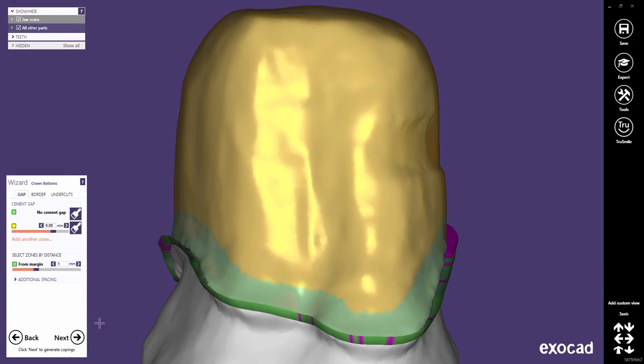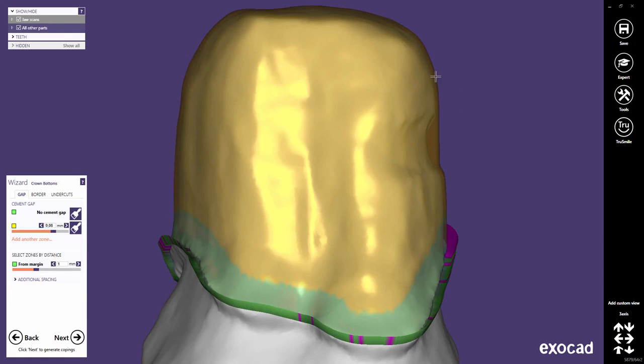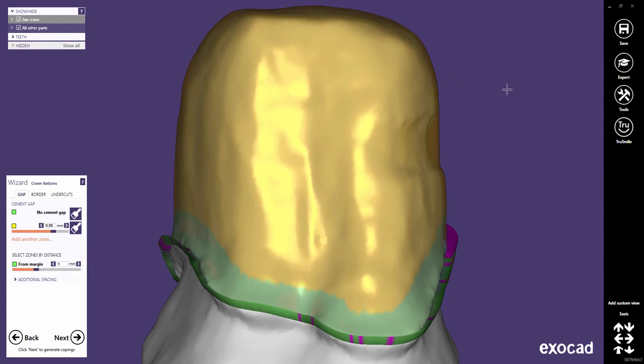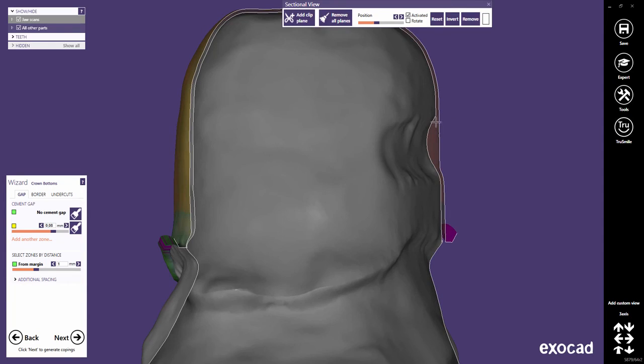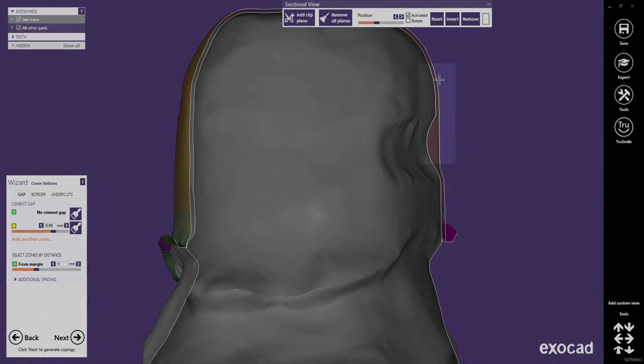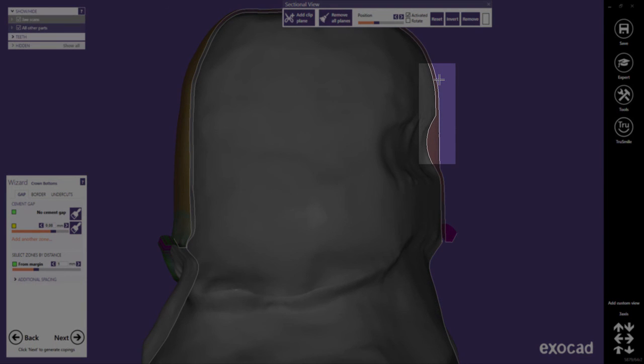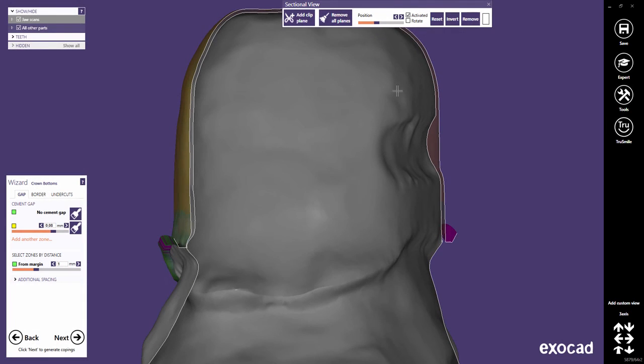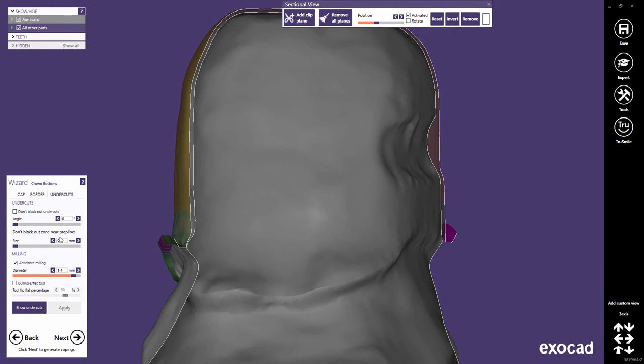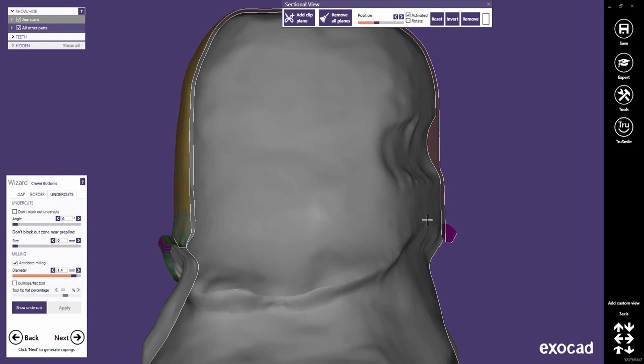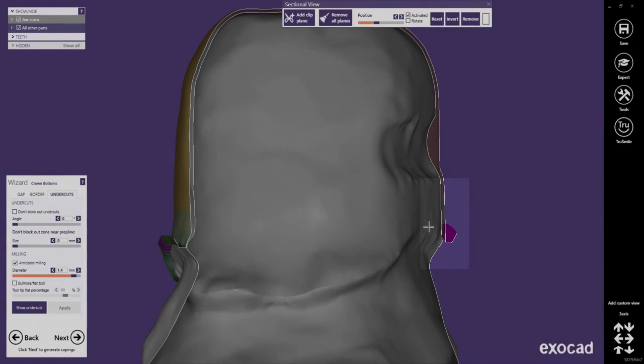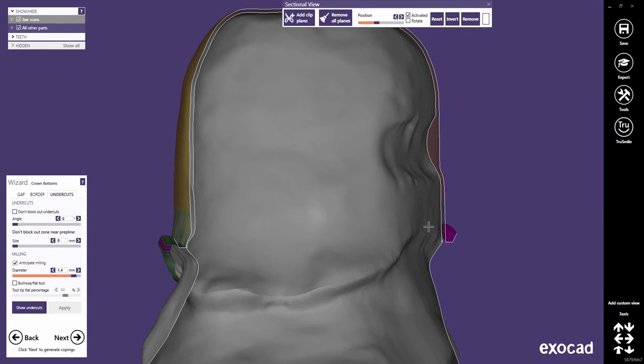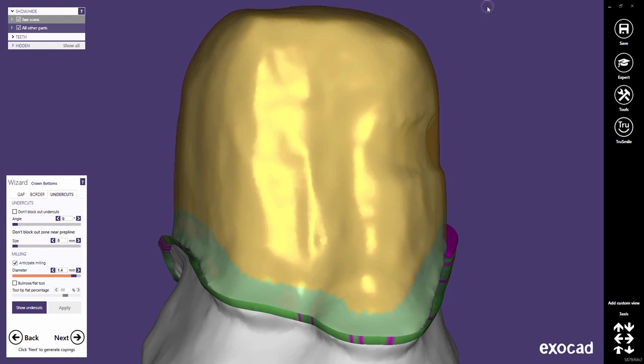For 3-axis production, material configurations typically define an additional blockout being applied after generating the cement gap to avoid any undercuts that 3-axis machines cannot mill. For the same reason, undercuts are very often blocked out all the way down to the margin using a value set to 0. But this configuration could create gaps in the crown border. As already mentioned in this tutorial, such gaps are to be indicated with magenta color on the borders.